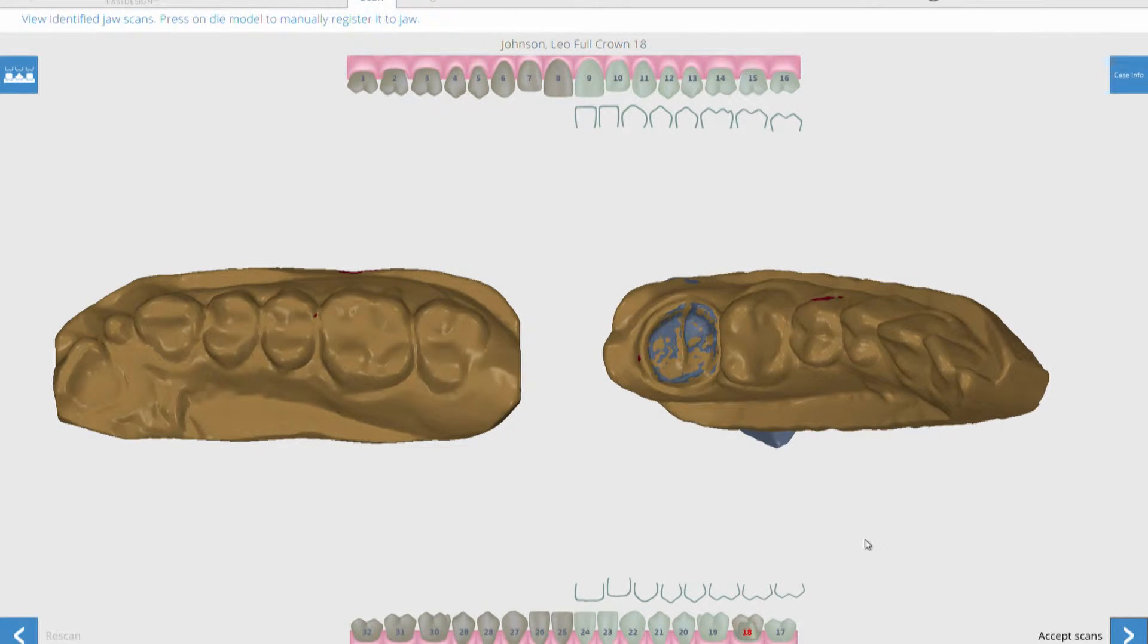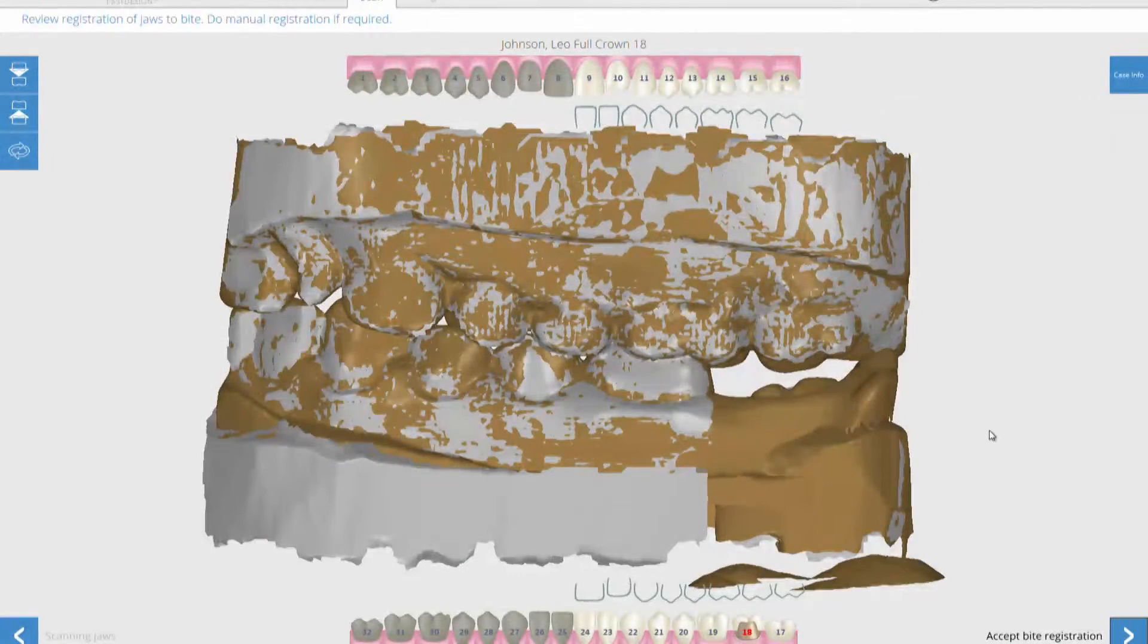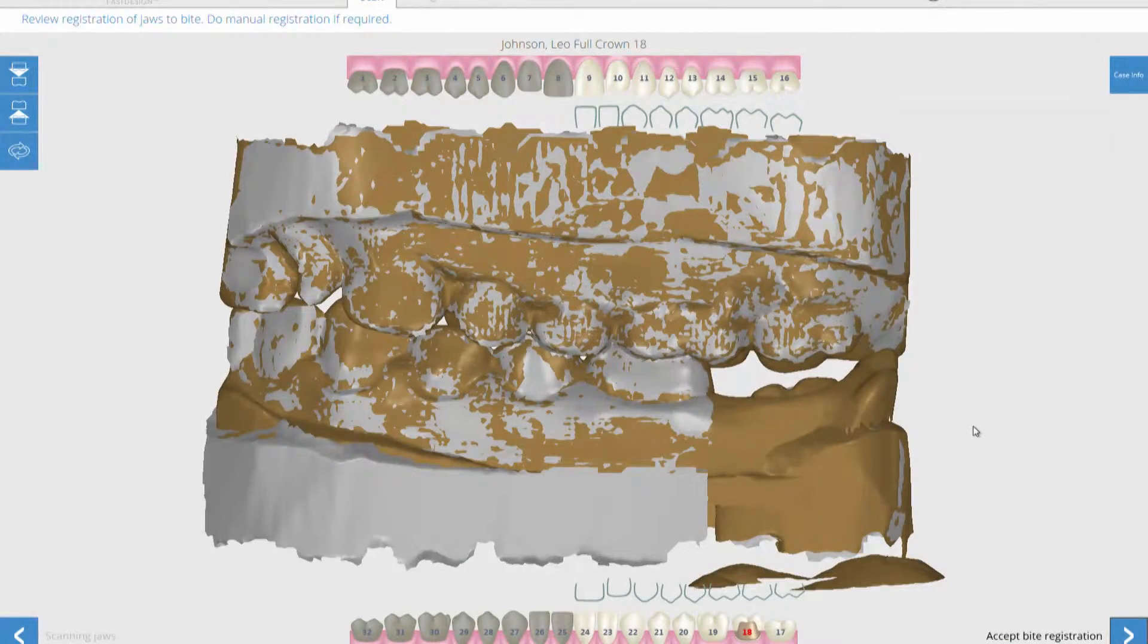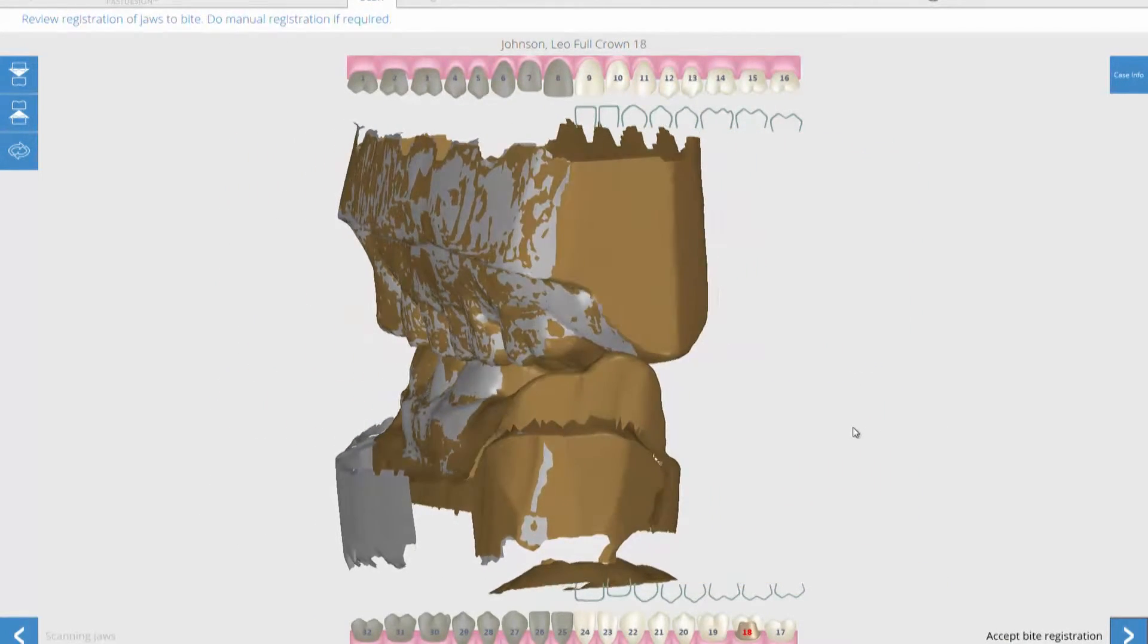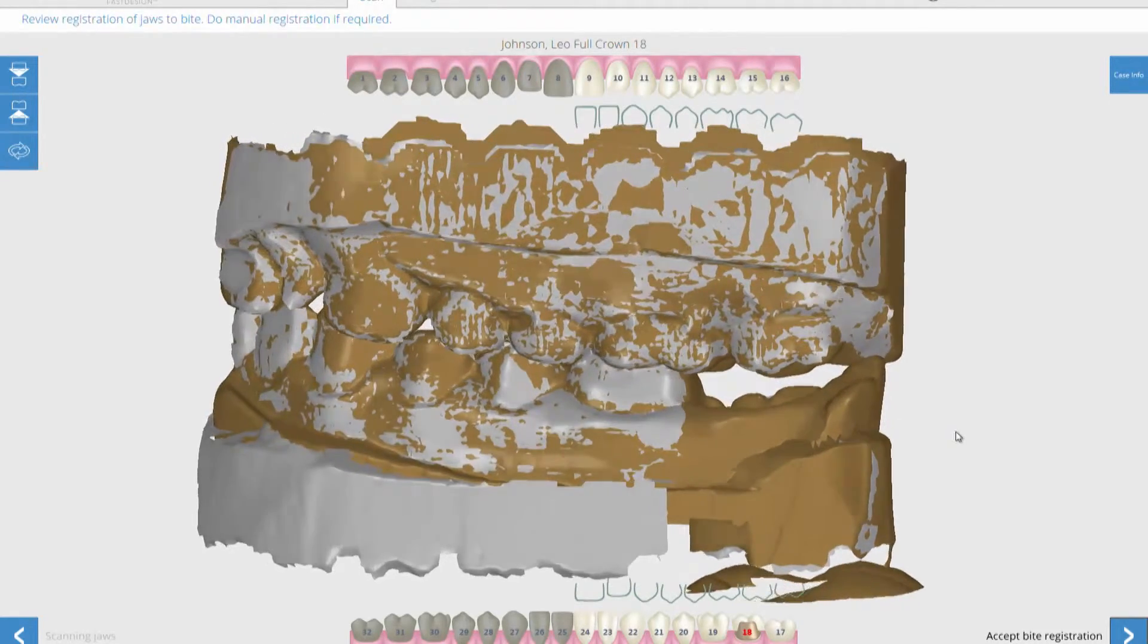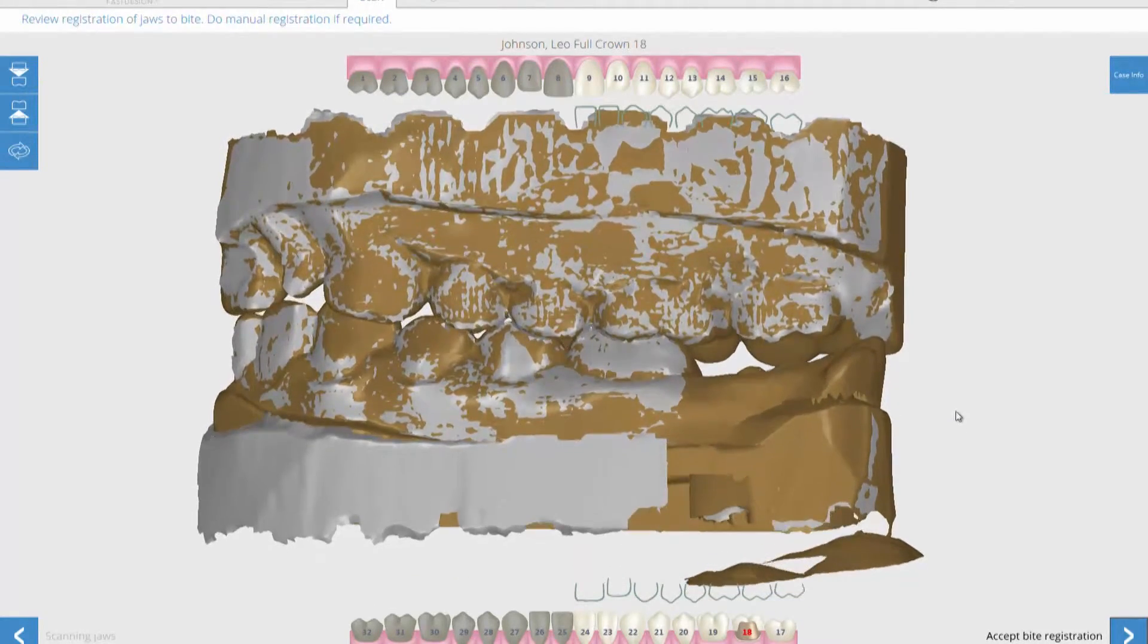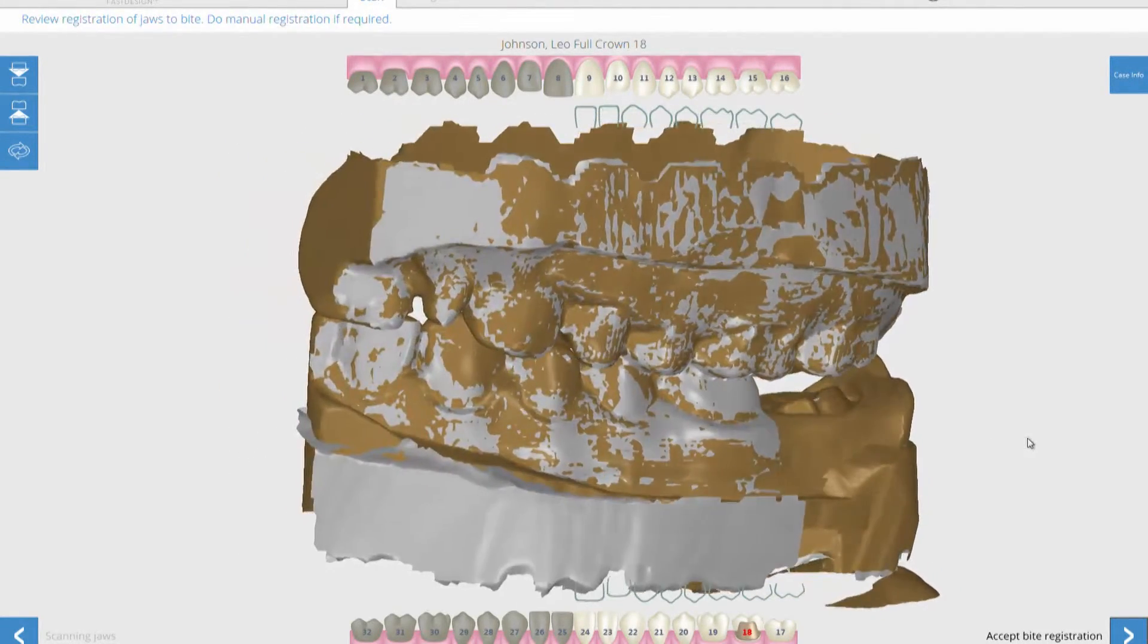This step also automatically articulates the opposing and solid models using the buccal bite scan. The speckled image indicates that the models are properly articulated according to the bite.